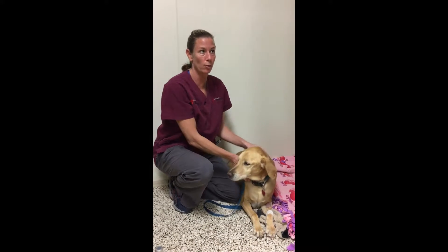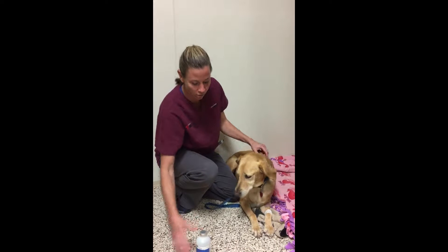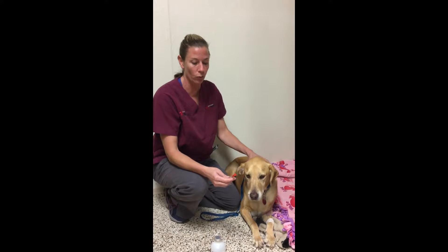Hi, I'm Jen from Baldwin Animal Clinic. I'm one of the techs here, and today we're going to talk about insulin injections. Toby here, our little patient, is a diabetic, so he gets insulin twice a day every 12 hours.